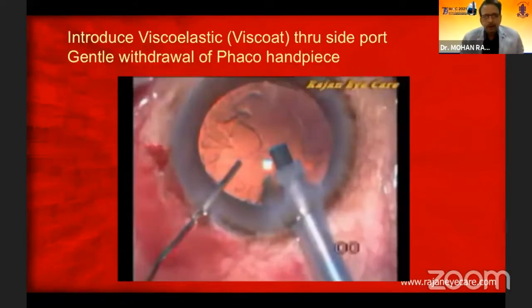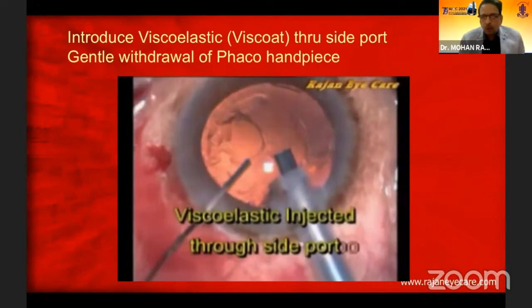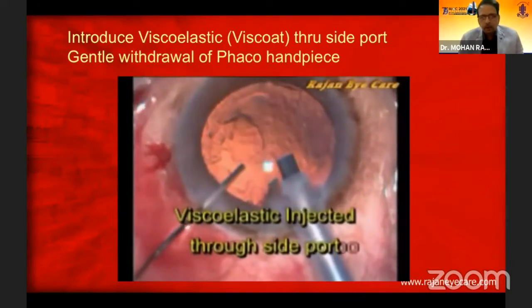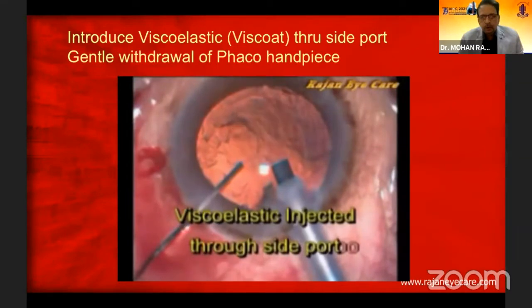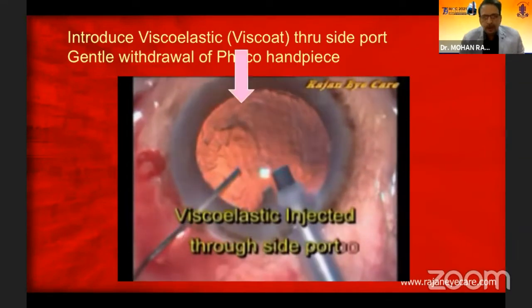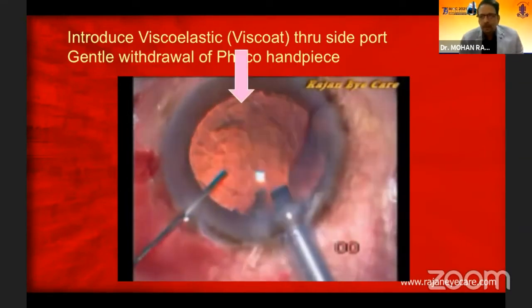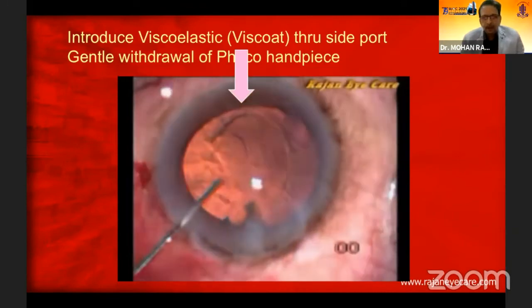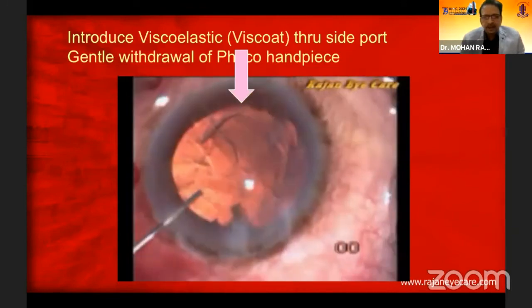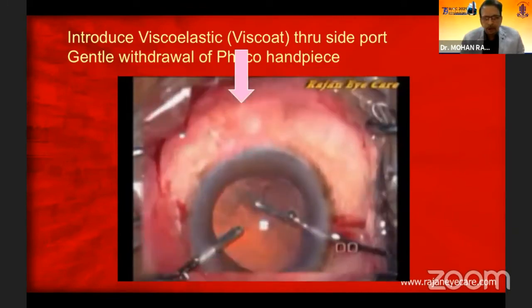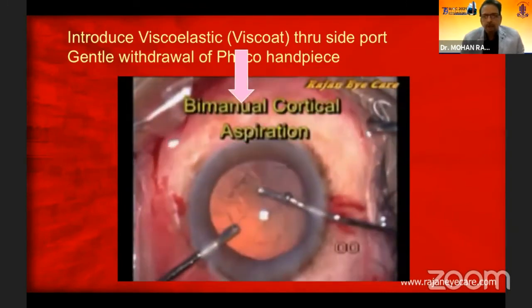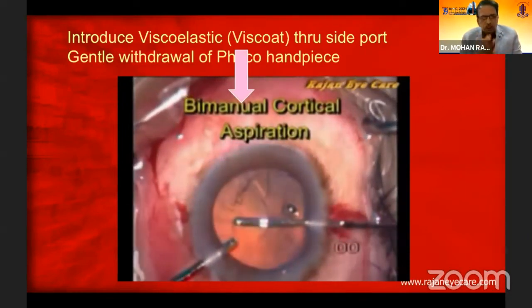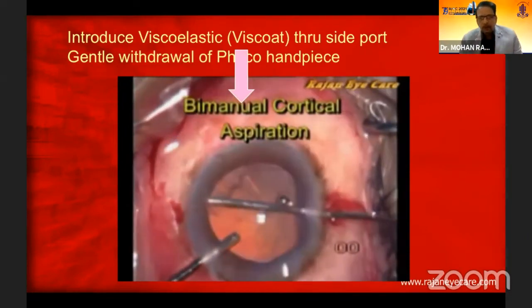When you have a PC tear, always inject viscoat. See what happens — when you inject viscoat there, you can see the small PC tear gets tamponaded at the break. Once you stabilize the anterior chamber, slowly withdraw the phaco tip and then go in for bimanual. Once you have a PC tear, switch over from coaxial to bimanual — create a right side port.